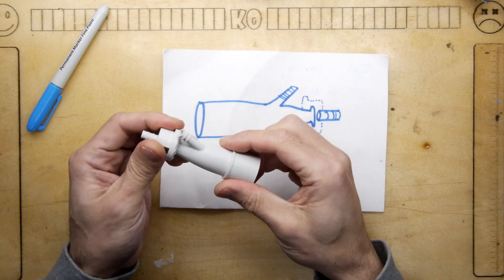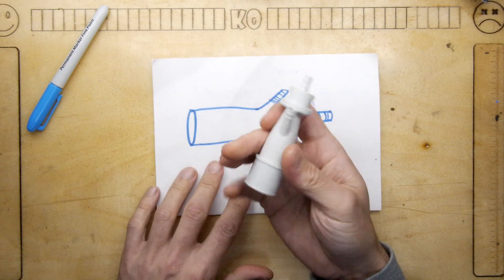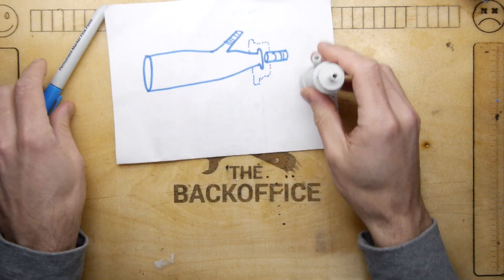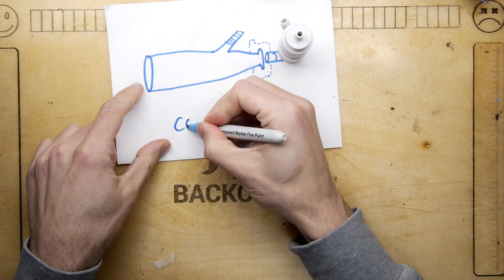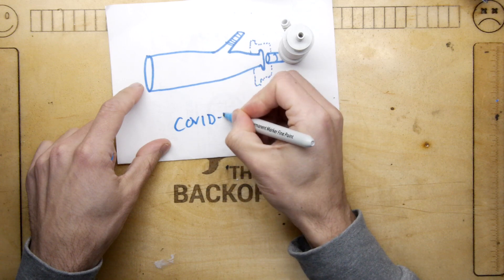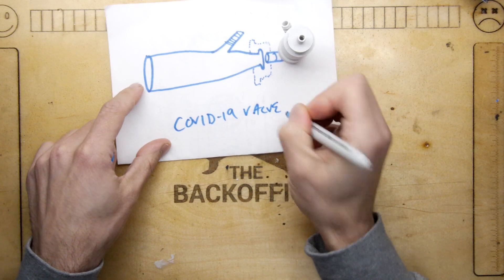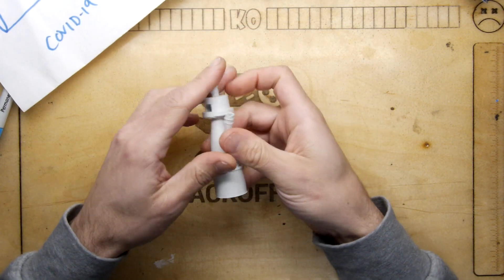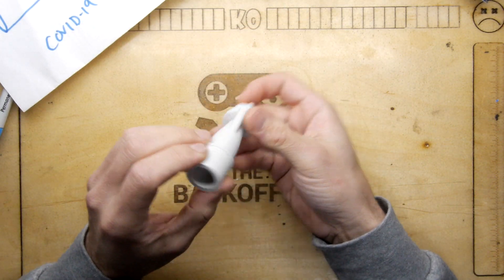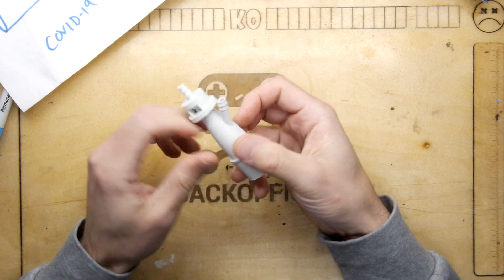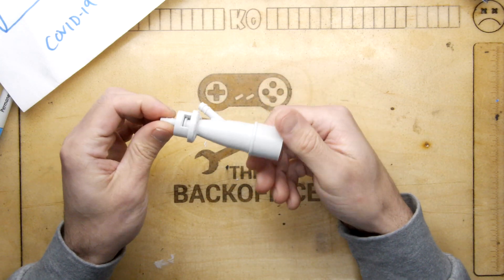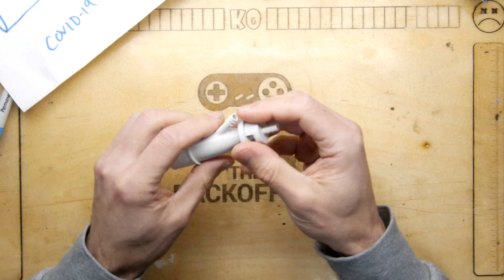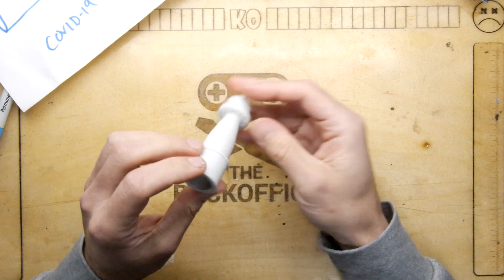If you want one, go to Thingiverse right now and type in 'COVID-19 valve' - not rocket science. That's where I got that model from. Just print one out and have a look. You never know - maybe if you fall ill, put it in your pocket and take it with you.